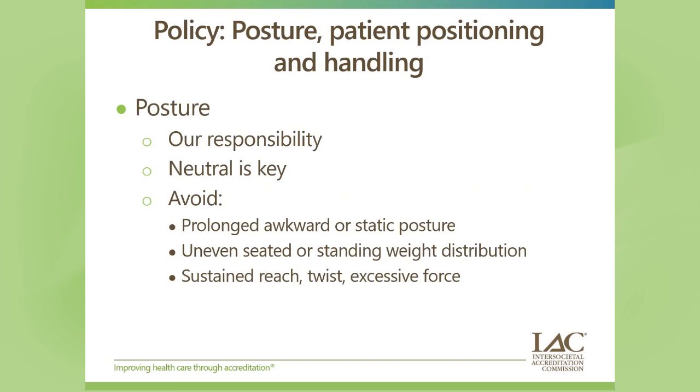All right, let's move on to the part where we discuss posture, patient positioning, and handling. And so this kind of comes down to that part for us. Posture is our responsibility, and as we've already talked about, neutral is key. So we want to avoid a few things, including prolonged awkward or static posture. I know that this can be challenging sometimes, especially when you're going portably, but think about taking micro breaks so that you're not in that prolonged position. Also avoid uneven seated or standing weight distribution.